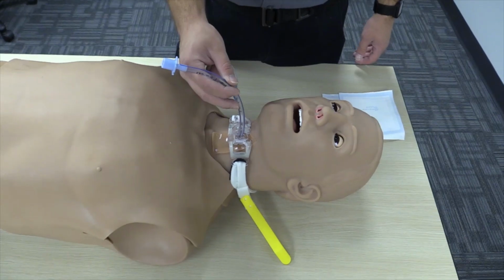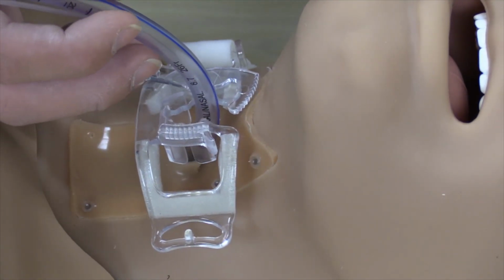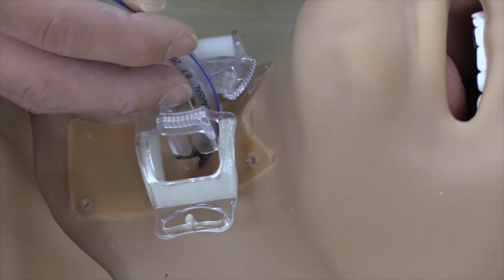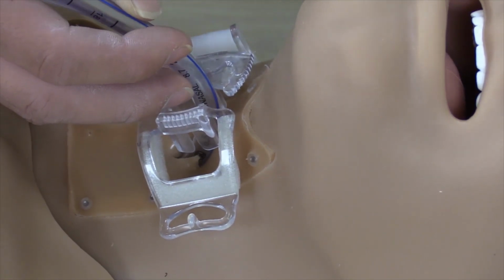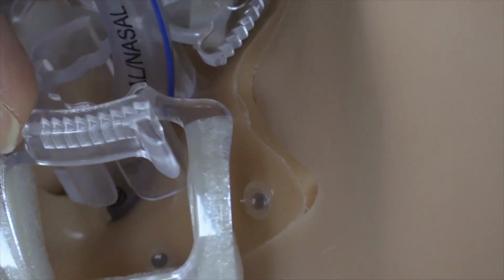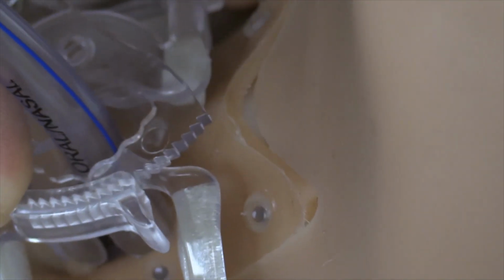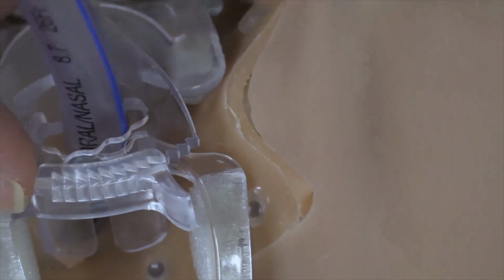Thank you. Hey guys, real quick, I just want to go over this securement device and how it operates. Just playing with it, having it facing up with the opening seems to be the easier way to approach it. Again, you can see these teeth right here. After we place the ET tube in, it's simply going to click in, and you can hear it here and lock. Make sure we're not pinching the tube, but it's going to lock.